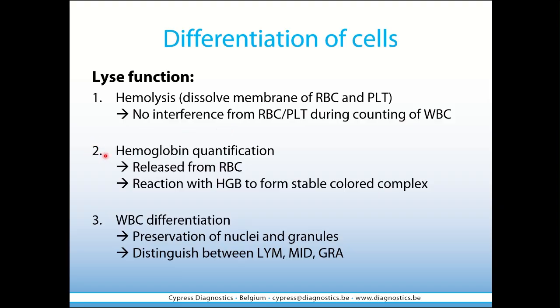Secondly, this will allow hemoglobin quantification, because when the red blood cells are destroyed, the hemoglobin content is released and can be measured. The lyse will then react with hemoglobin to form a stable colored complex, which can be measured.